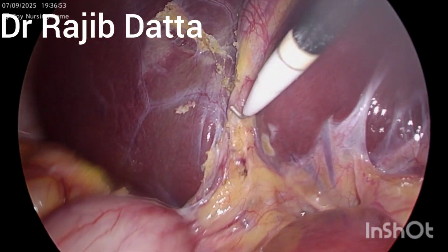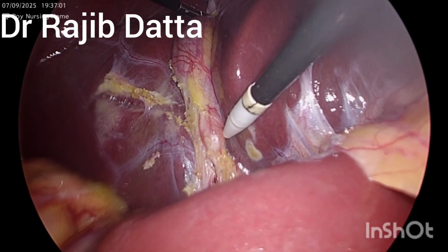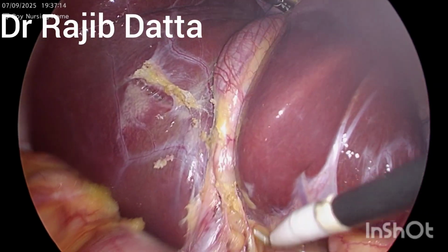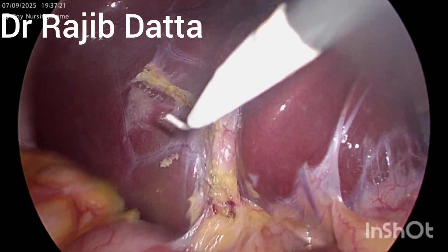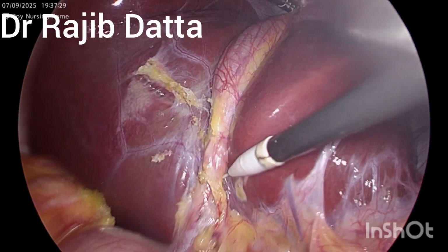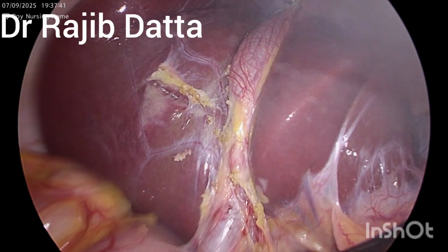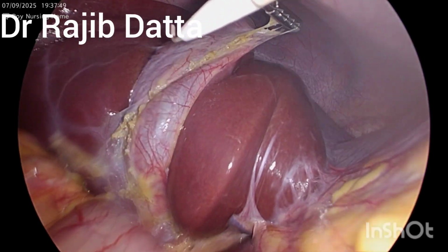So our anterior calot's dissection is going on. Posterior calot's is almost done. So anterior calot's dissection is going on, and small bites mean small mistakes. Don't go for big bites with the monopolar diathermy. There will be chances of injury. So small bites is the main key for proper dissection.